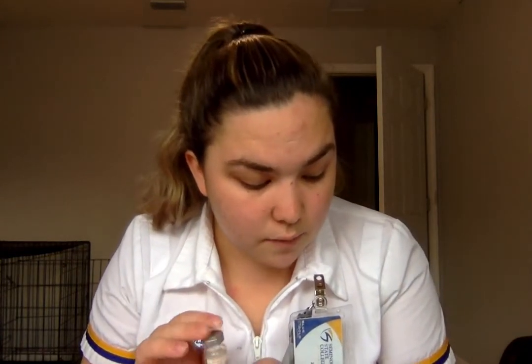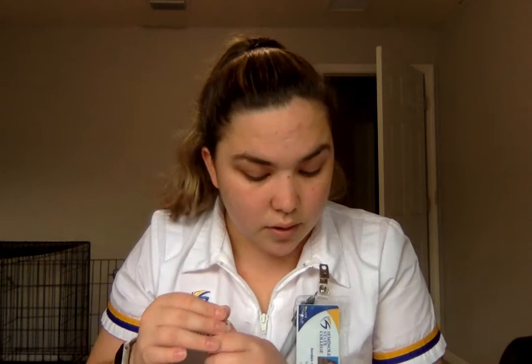I'm going to go ahead and do my 3rd check on my B12. I have the right patient, Anna Powolowski, 5/5/57. I have the right med, vitamin B12. The right dose is 0.5 mLs, which is when I did the dosage calculation. The right route, which is subcutaneous, and the right time, 14:58. So I did my 3rd check for this one.